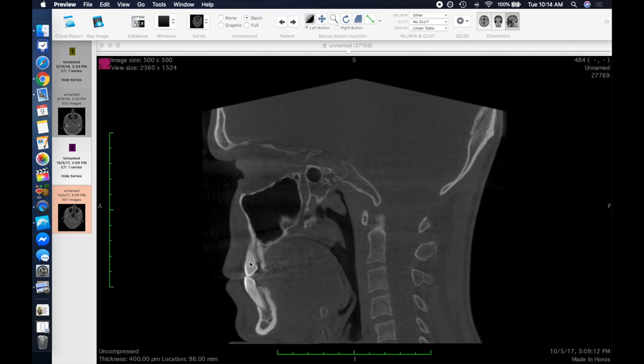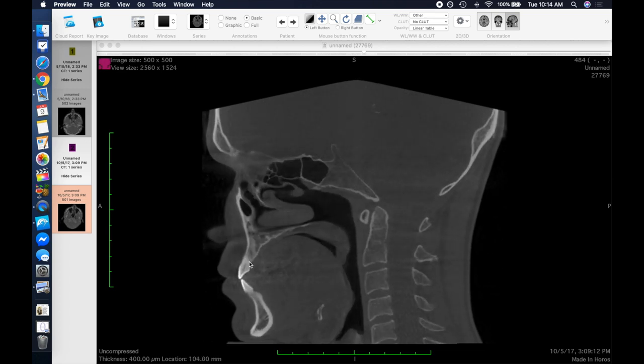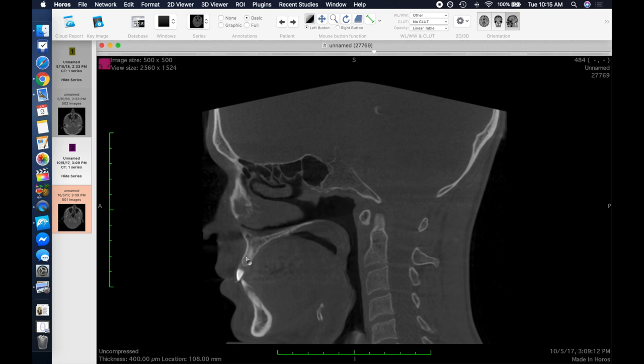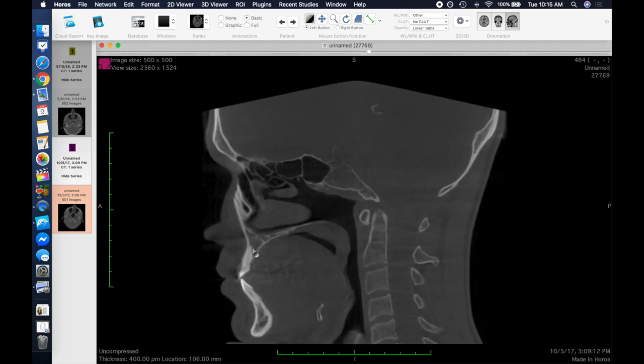Here we see a canine. And then here we see our first tooth. Now, if you look at this tooth, you see the root of the tooth in white, and it has a little bit of black going down the middle. And this darker stuff here is the maxilla. So you see some maxillary bone behind the tooth coming up over the root, and the maxillary bone wraps significantly up and over the tooth. Not a ton of bone there, but definitely the tooth is nestled in bone here.